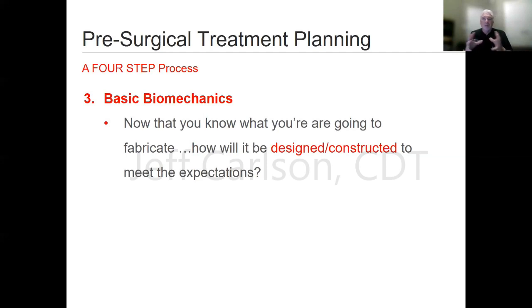Then once you've kind of zeroed in on what option you're going to fabricate, then you need to start looking at how you are going to design this case, the biomechanics of it. So, I always say, I'll ask people in a group, how long do patients expect their restorations to last? Just regular dentistry. And usually in unison, the group says a lifetime. And then I say, well, how long do you expect patients to think their implant restorations will last? And they kind of pause for a moment. Yeah, a lifetime.